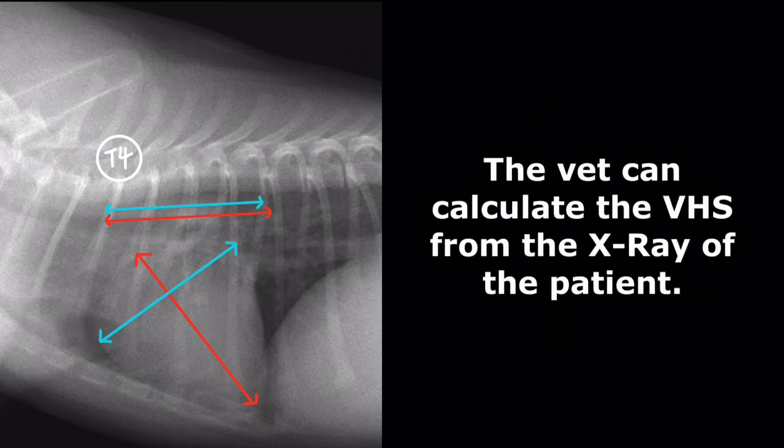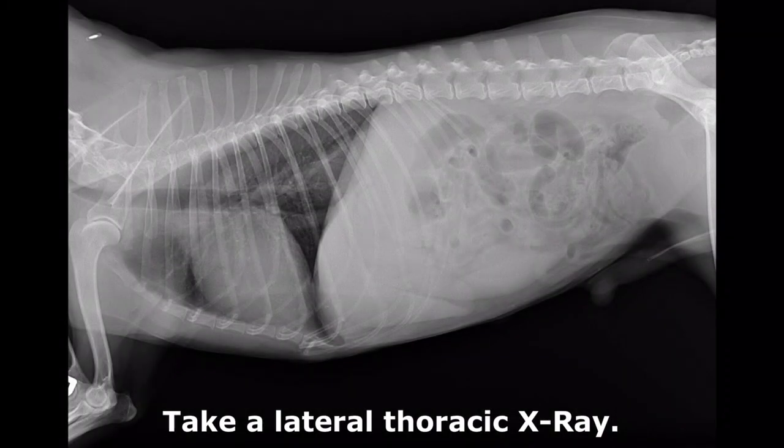When the patient shows symptoms of heart disease, the vet can calculate the VHS from the x-ray of the patient. First, take a lateral thoracic x-ray film. This is the x-ray of the miniature schnauzer.